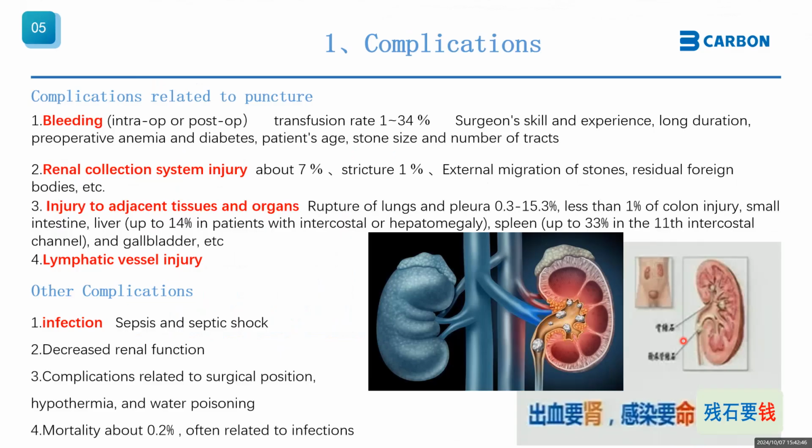There is no anemia or diabetes, the patient is not very old, and the stone is not very big. Just do one access, one tract PCNL, it's much safer.